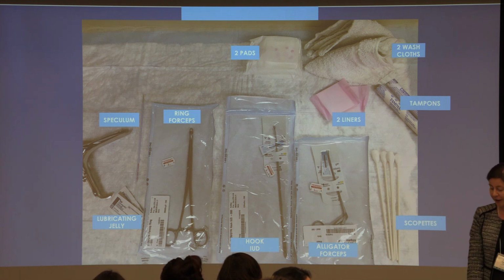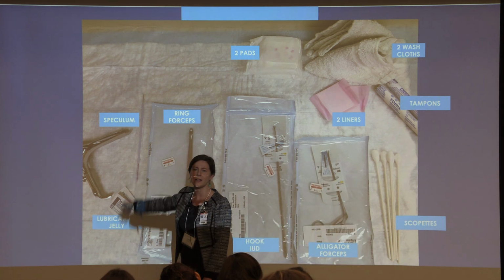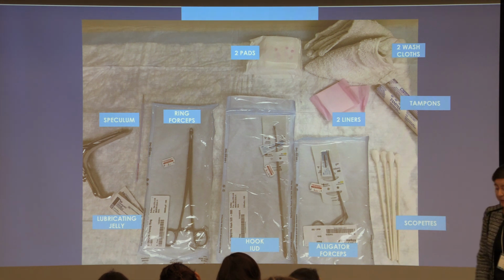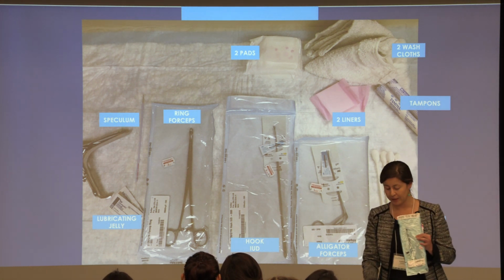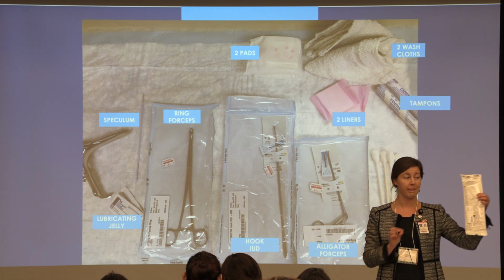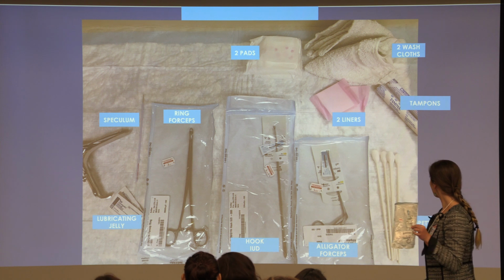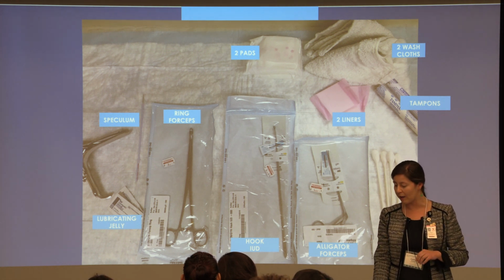Sometimes we like to offer what you're seeing here. This is like a little, you see them with your pap smears, right? These are your cervical ECC. Sometimes if the strings are hard to find, those can be helpful. Your ring forceps. Sorry, that was our little ECC. Ring forceps. We have IUD hooks. Alligator clamps, as you'll see there. Also not noted here, sometimes we use a long hemostat. That can be helpful as well.